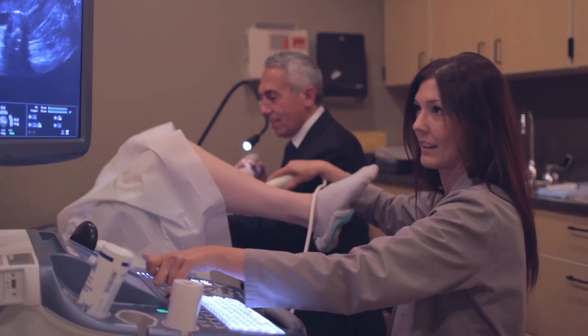Here's a typical case where I feel the Miller Advanced Catheter really proved to be an advantage. A 29-year-old Gravida Zero was referred to me from her doctor for further fertility workup. She had cervical stenosis and a severely retroflexed uterus — two difficult features when dealing with the older time-worn catheters. I ended up performing a femvue procedure.